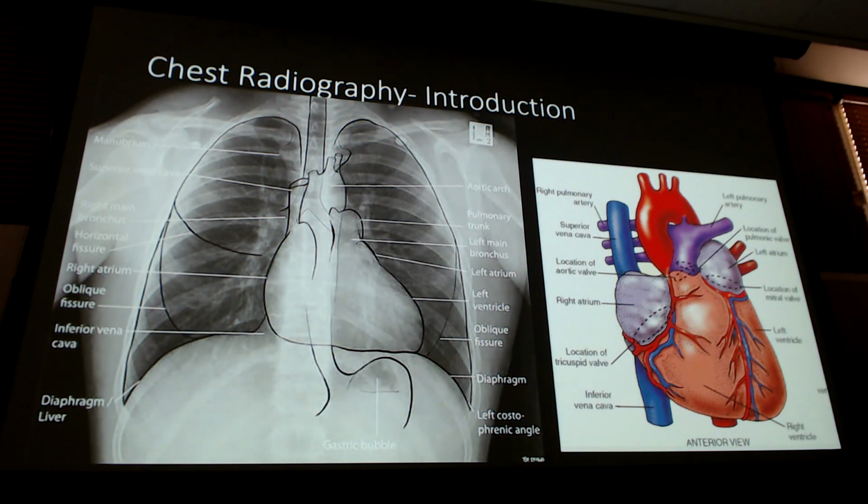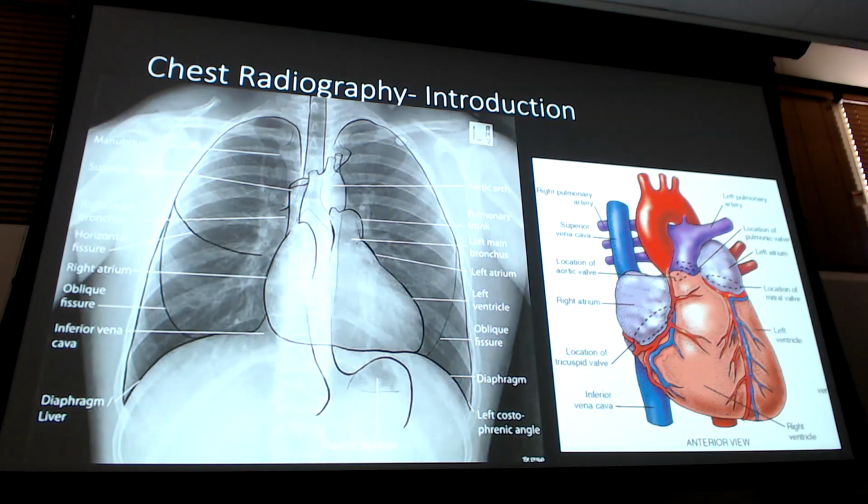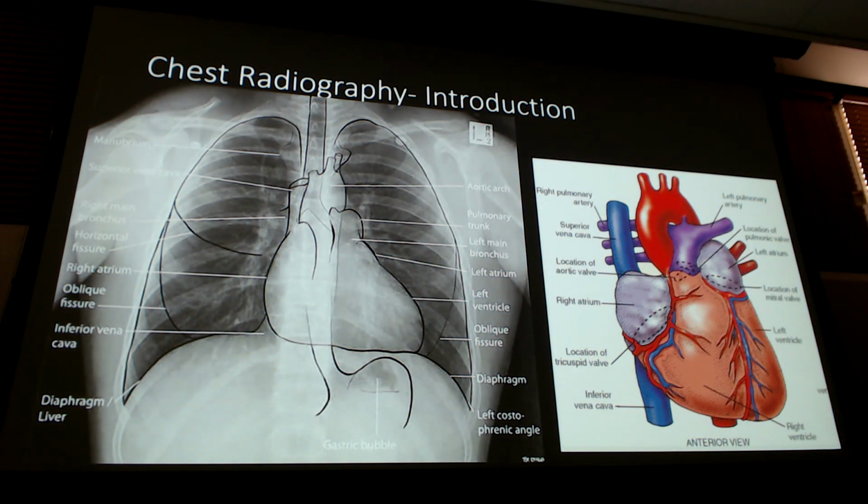Here is where I need you to live as you're starting to learn this stuff. This one and this one. Okay? You can go to Radiopaedia, you can type in PA chest X-ray normal annotated to give you other viewpoints of this. I harped on anatomy last time, same thing for this one, and even a little bit more important in this block. Okay? So let's take a look at the anatomy a little bit.